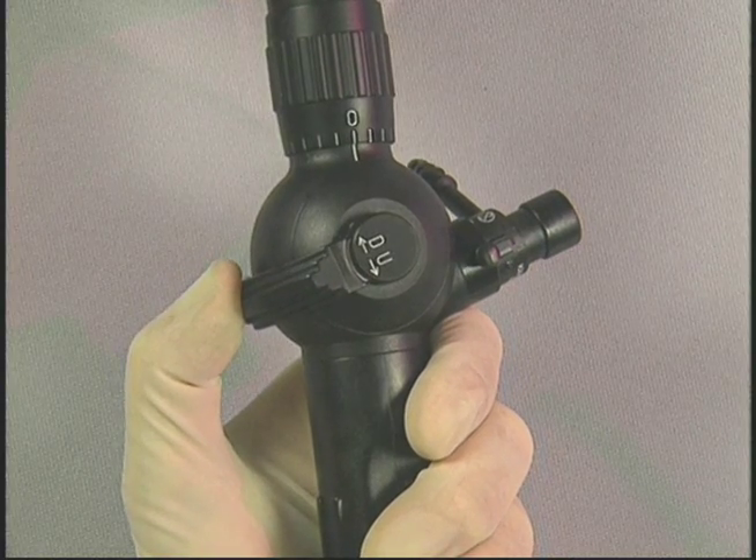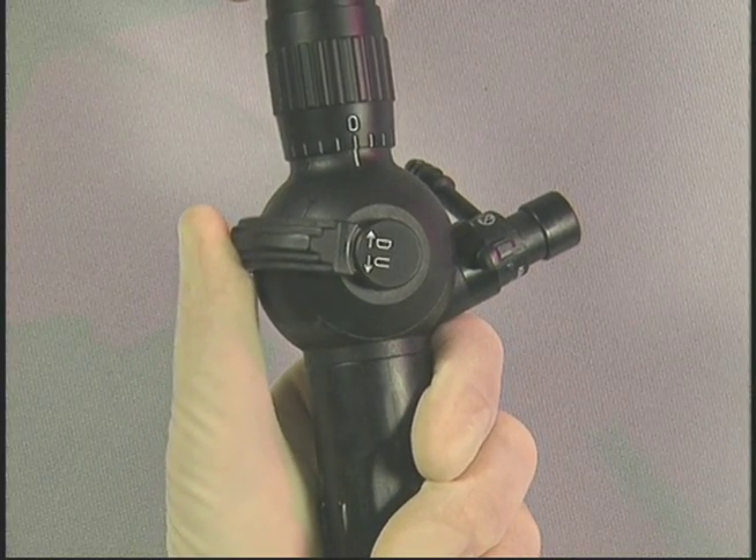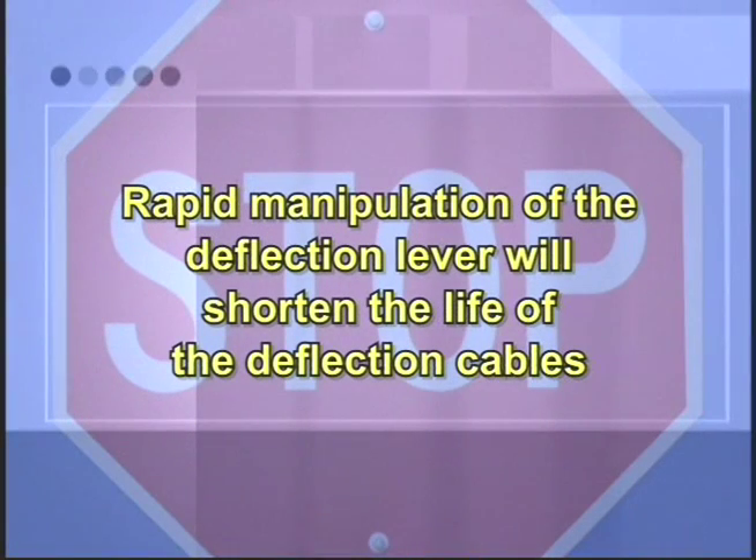Slowly manipulate the deflection lever to see that it functions smoothly. Rapid manipulation of the deflection lever will shorten the life of the deflection cables. Normal deflection is 140 degrees both up and down, less than one half of a circle each way.